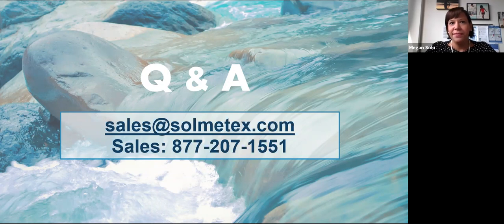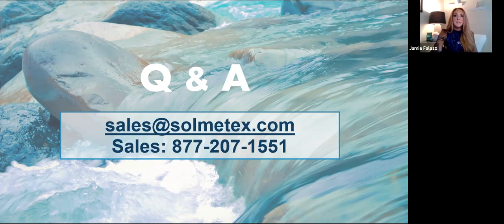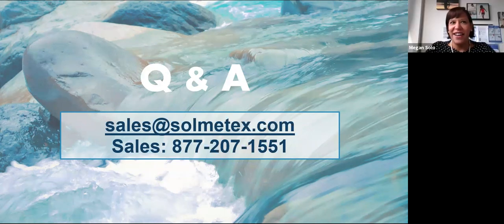Okay. All right, here's another one. I never place amalgam. Do I really need this? We get this question a lot. Even if your office is composite only, you're still working on patients that have amalgam in their mouths. So you will need to comply with the regulation. Your chairside traps and vacuum traps still need to be disposed of in an amalgam bucket as well.